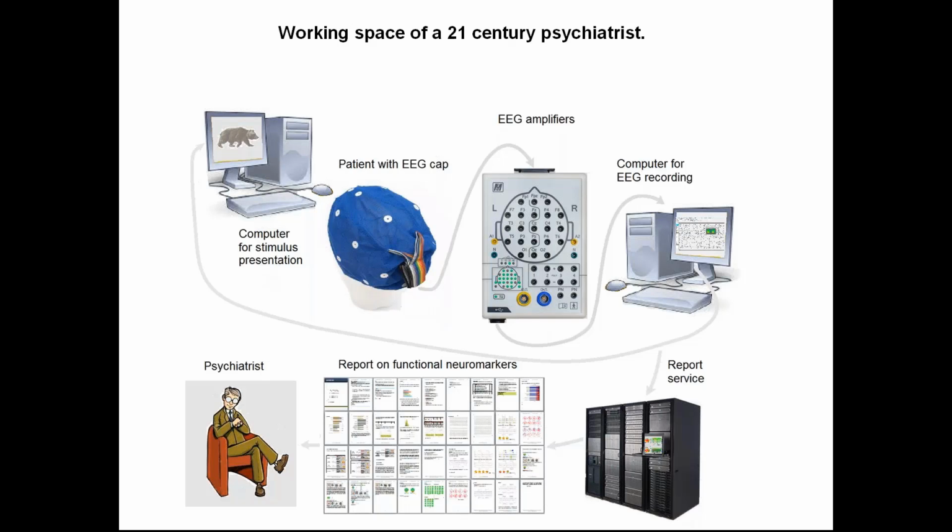The psychiatrist usually doesn't have enough time for doing the analysis by himself, except some advanced psychiatrists, but he usually sends the EEG for analysis to a center of specialists who produce a report on functional neuromarkers.